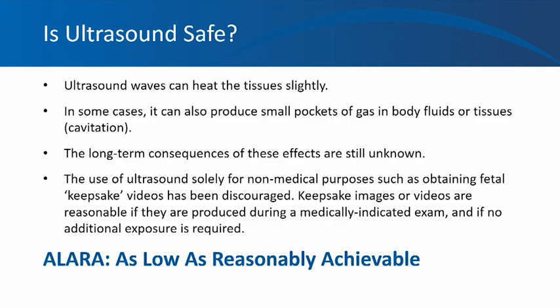And finally, is ultrasound safe? Nobody knows. Ultrasound waves can heat the tissue slightly, and in some cases it can also produce small pockets of gas in body fluids or tissue. That's called cavitation. So the long-term consequences of these effects are unknown. And the FDA recommends strongly against fetal keepsake videos with those 3D, 4D probes, unless it's a medically indicated exam, then you can obtain those pictures as a part of the study.